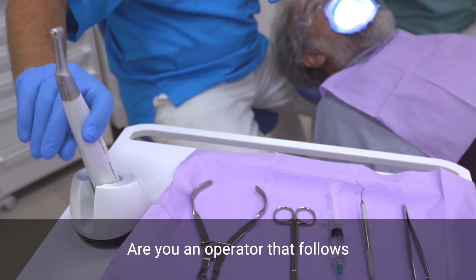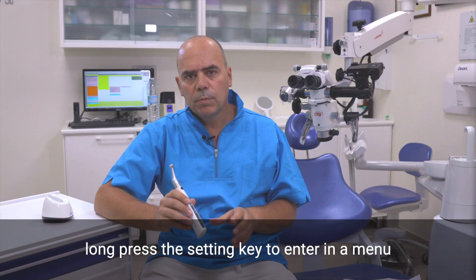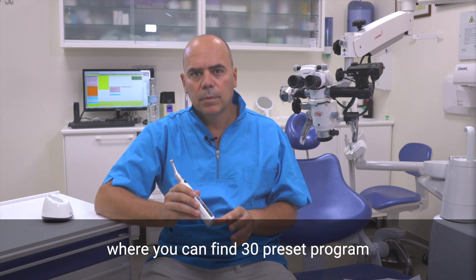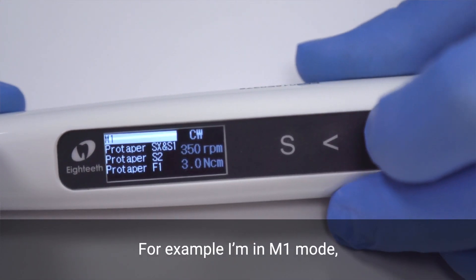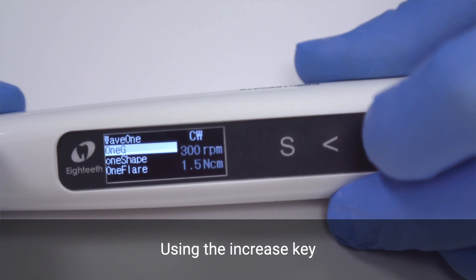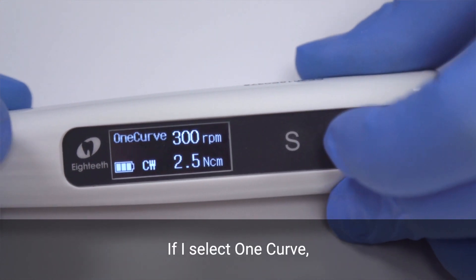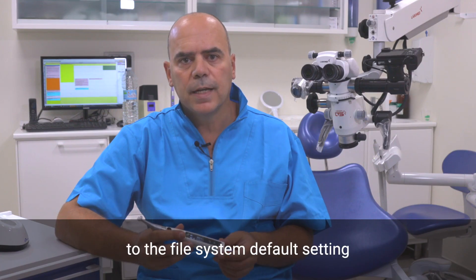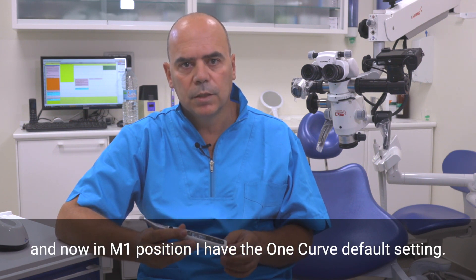Are you an operator that follows the default rotary file settings recommended by the companies? No problem — long press the setting key to enter a menu where you can find 30 preset programs for the most common file systems available in the market. For example, I am in M1 mode. By long press of the S key, a list of file systems appears. Using the increased key I can find the file system I am looking for. If I select OneCurve, the operation mode, the speed and the torque limit will change according to the file system default setting. And now in M1 mode, I have the OneCurve default setting.